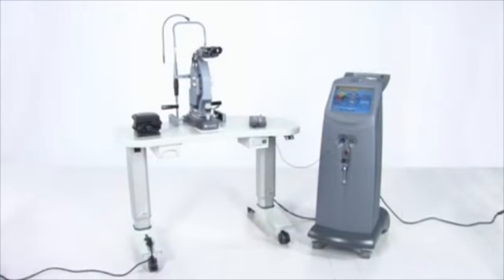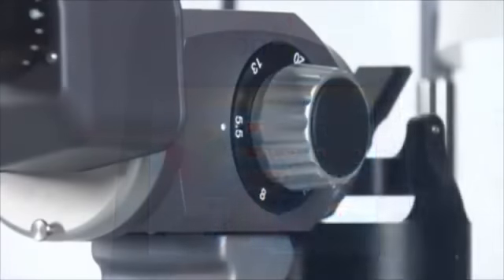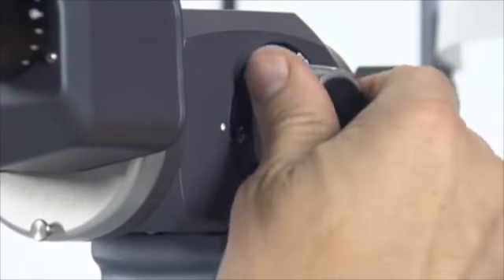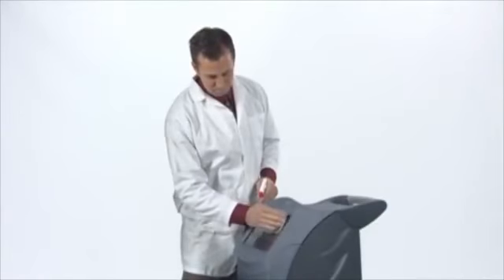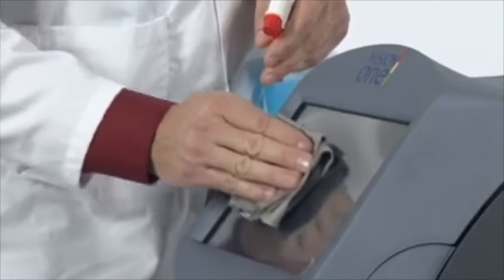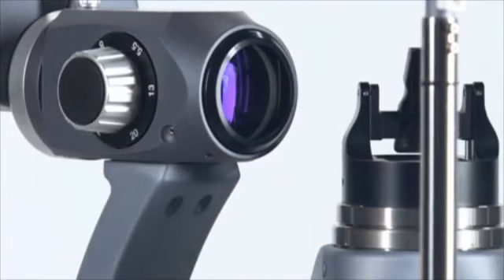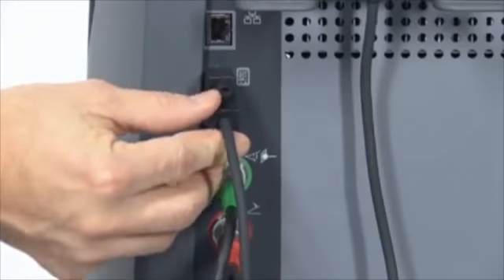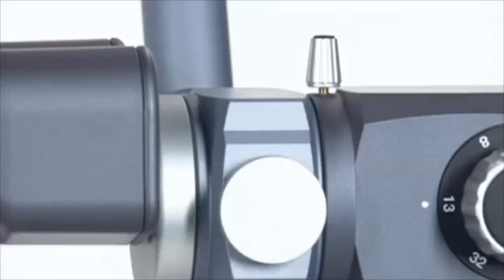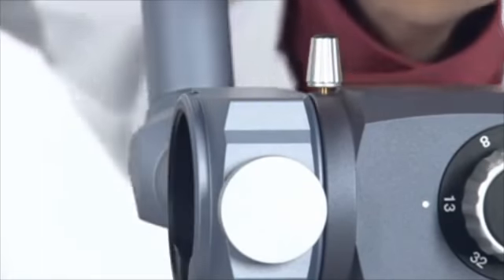Your local Lumenis representative will initially uncrate, inspect, set up, and install the laser to ensure that it is working properly. In addition, Lumenis provides in-service training to ensure that your surgical staff is experienced with the performance and safety considerations of the laser. Thereafter, you or the nursing staff at your facility will perform the daily maintenance routines associated with the laser and delivery devices, including inspecting and cleaning the laser and delivery devices, connecting and disconnecting the delivery devices, and verifying the aiming beam. These procedures are detailed in this presentation and in the delivery device operator manuals.